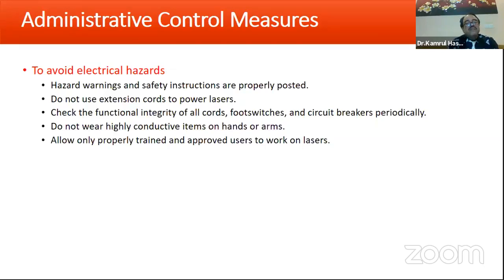It's better with a colored substance, gentian violet, the blackish one. By this, if there is any leakage, you can see the leakage of the cuff.